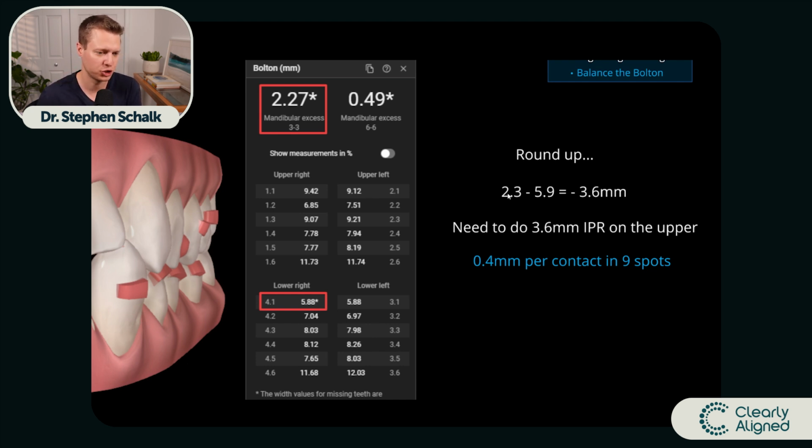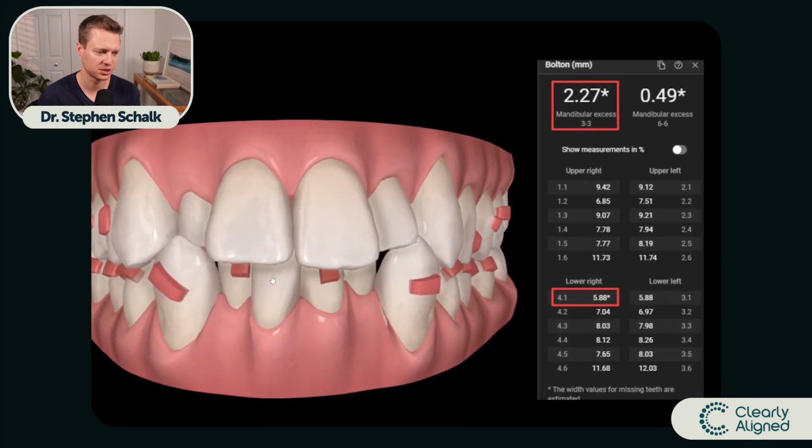So if the box was too big, but now we've made it smaller by cutting out some of that box, now the lid is actually bigger than the box. It doesn't quite fit properly. So we need to do some adjustments on that top arch. Makes sense, right? We're taking out an entire tooth on the bottom.